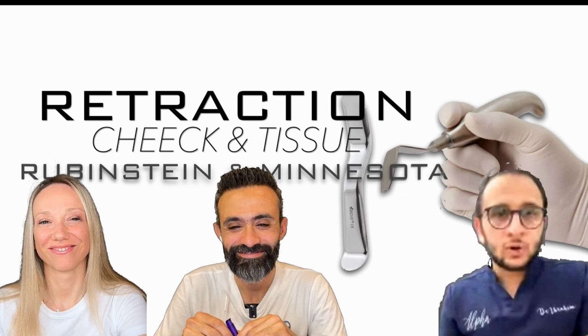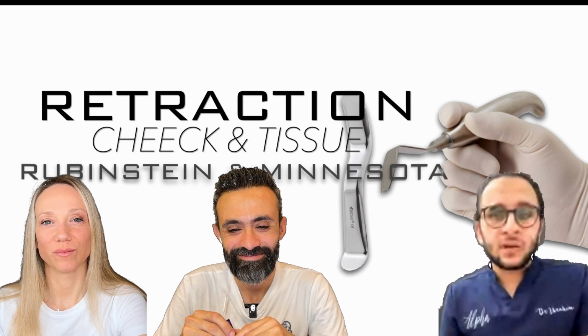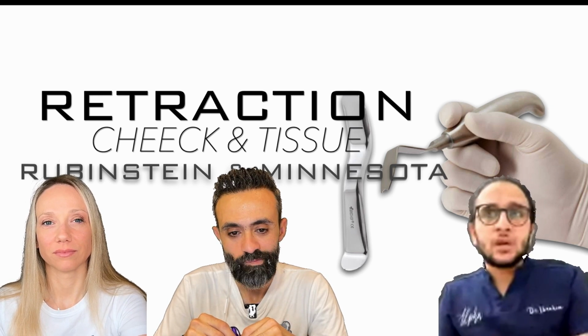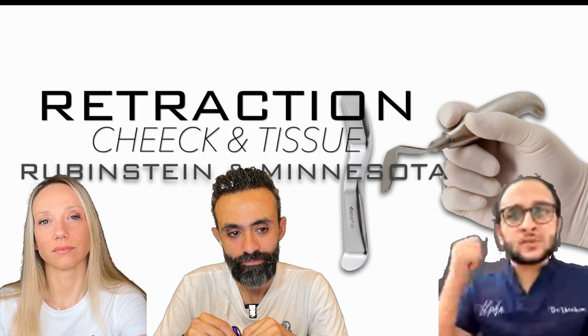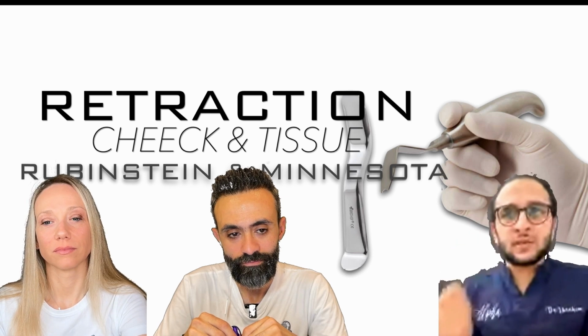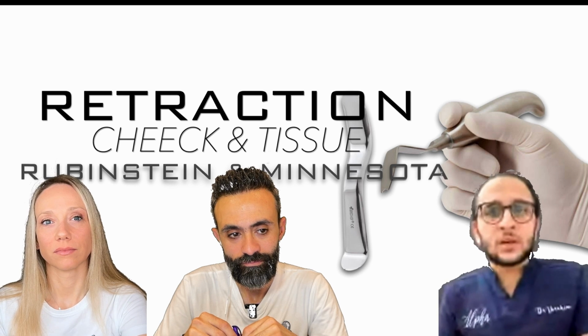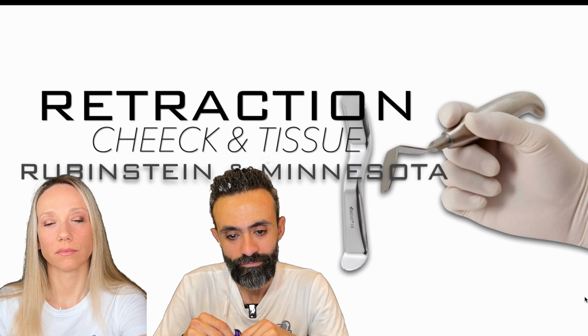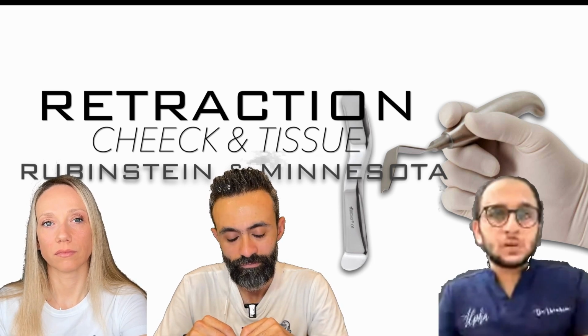So retraction is very, very important, and we can classify it into cheek and tissue retraction. For the cheek retractor, we use the normal Minnesota, and we have a specific retractor like the Rubinstein for retraction of the flap. The Rubinstein one comes in a small size and a large size, depending on the flap.